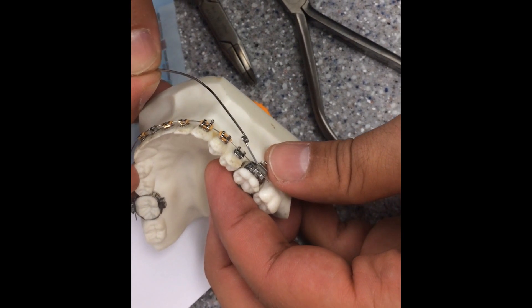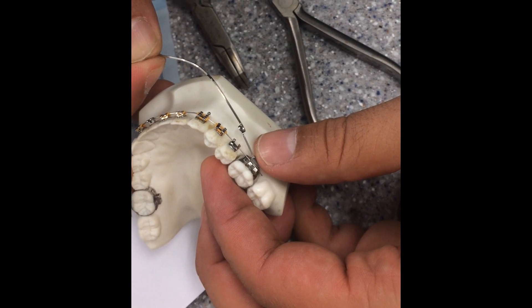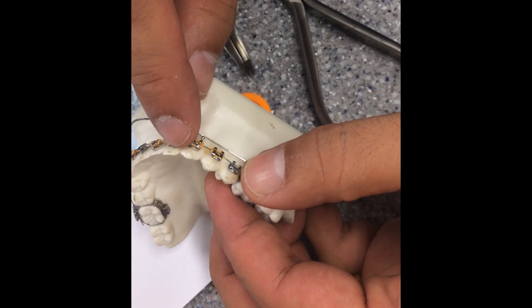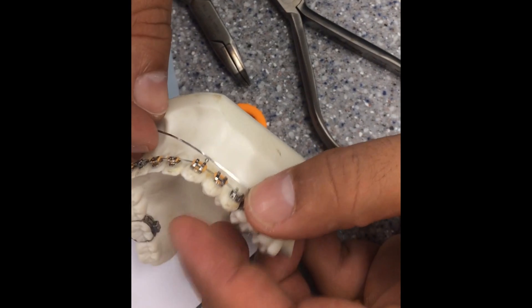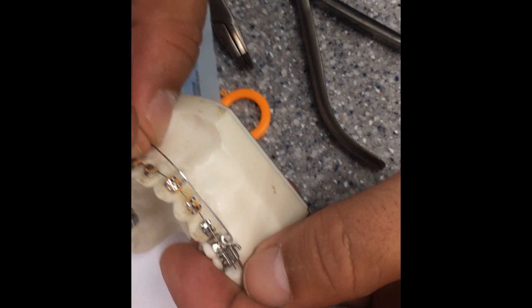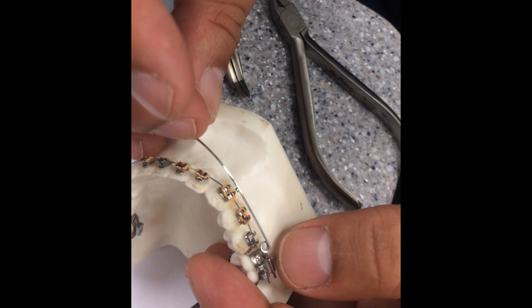So as you're going to be measuring, you don't want your cantilever to be too tight on the molar tube, nor too tight here. Because as you're reversing the curve, you will pro-cline incisors and increase the arch length. So you don't put it there — you go a little bit forward like this so you have some clearance from the tube.